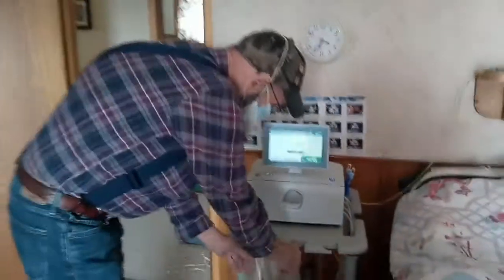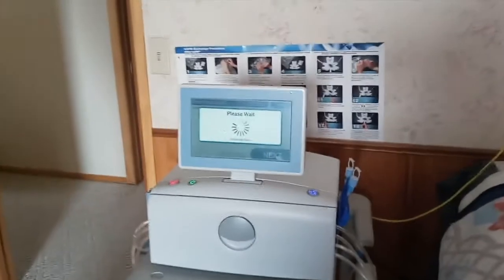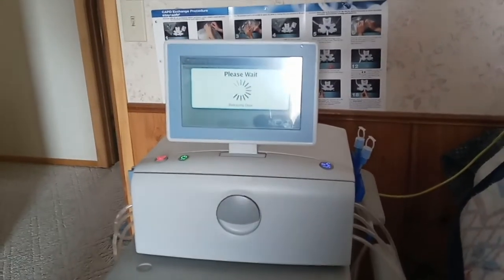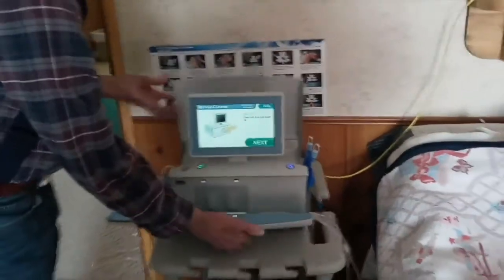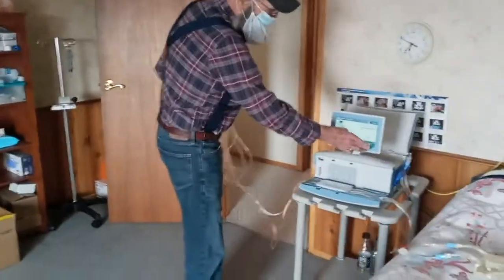It's pumped all the fluid out. The bags are empty. So I pull these out, set them up here. Now that's releasing the door. Open front door and heater lid. Remove drain line from drain. I always put this thing back in here and push them together so it doesn't leak. And then I roll it up. And we're ready for next.